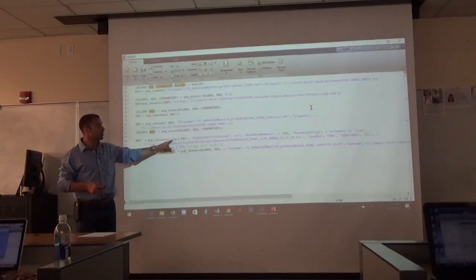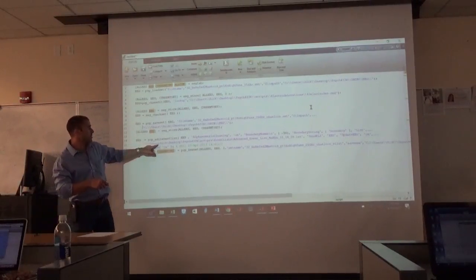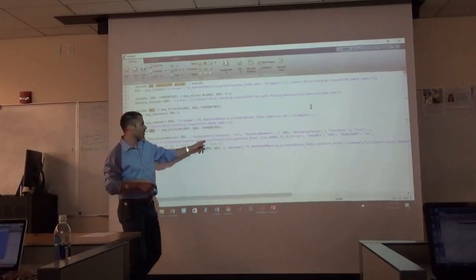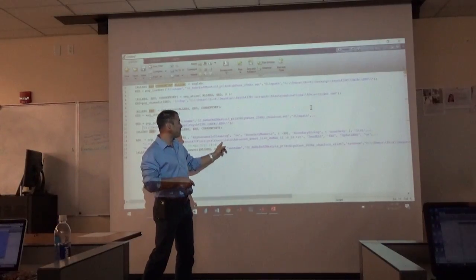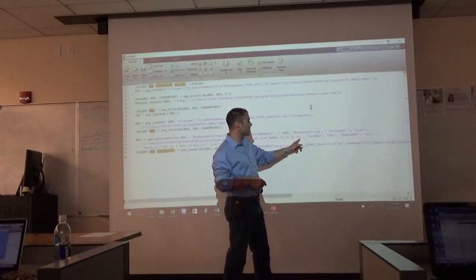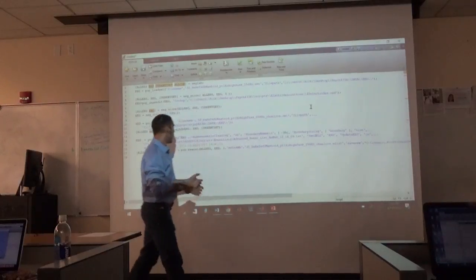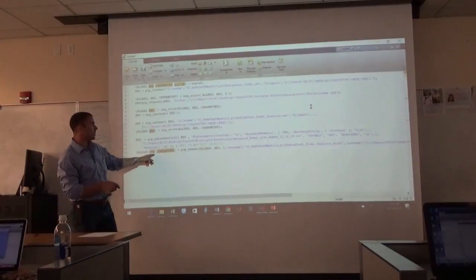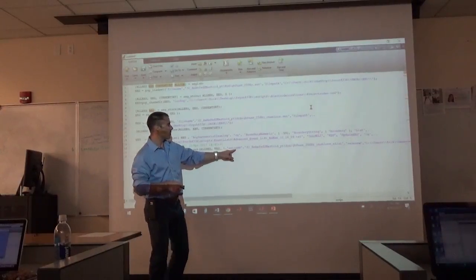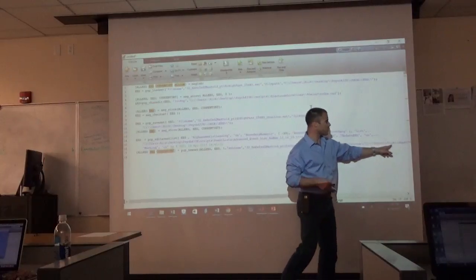So from there, all we did was load this directory: users, me, desktop, the folder. In the scripts was our file for the event list, called advanced event list 12.1609.txt. You don't have to worry about any of this other stuff. And then all we did was save the new data set with the name that we had here, channel locations with eList, and that's the directory that we saved it in.